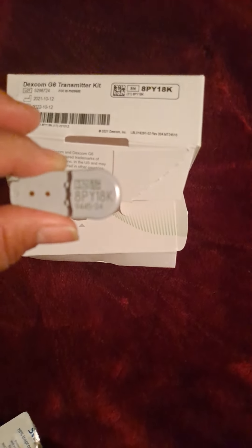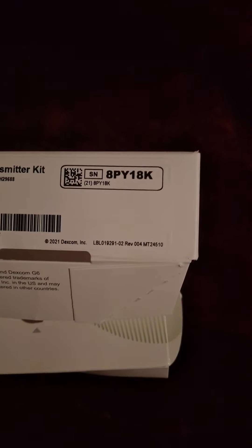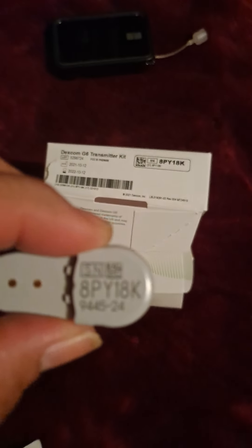This is the box the transmitter comes in — a smaller box inside, and that's the transmitter. It'll also have pamphlets to teach you how to use it. Each transmitter has its own serial number on the back as well as on the box. This is important because you're going to need to put the new serial number inside the insulin pump in the settings.